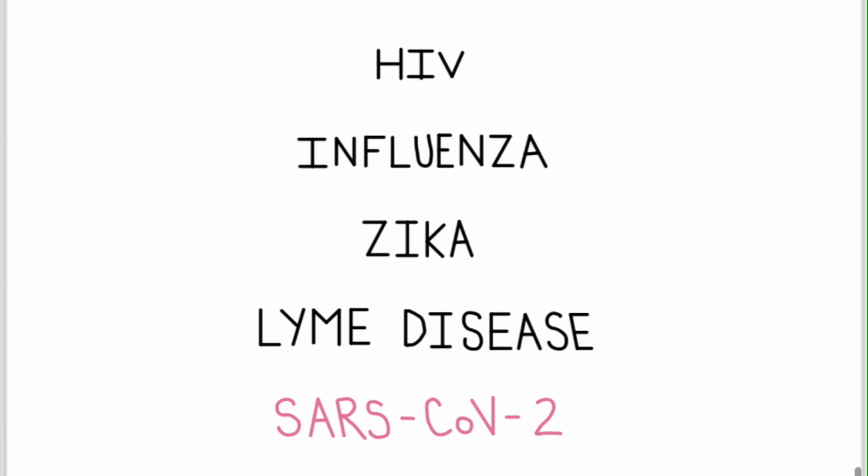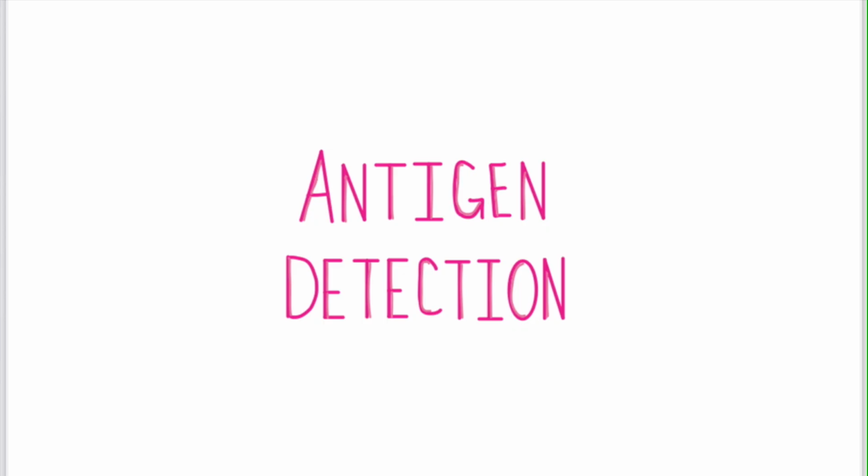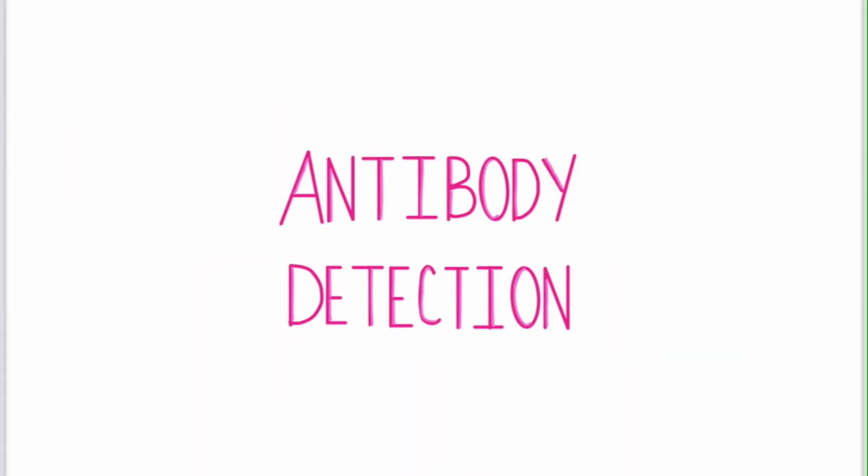When a person becomes infected with a virus, viral antigens appear first and trigger the immune system to make antibodies. Over time, as antibodies increase, they help destroy the virus and the antigen level falls. That means an antigen detection ELISA is best for finding an active infection, while an antibody detection ELISA tells us if someone has mounted an immune response or has had a past infection.